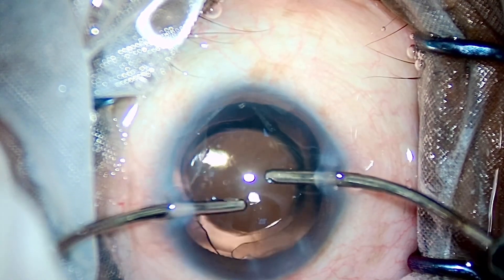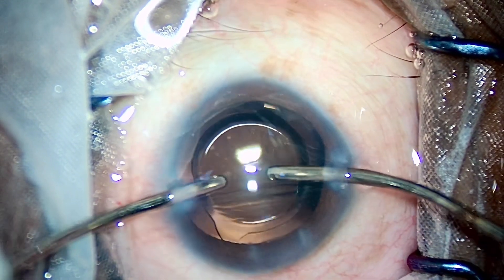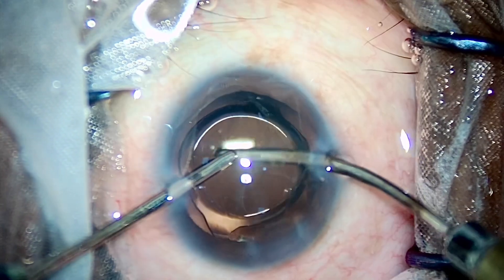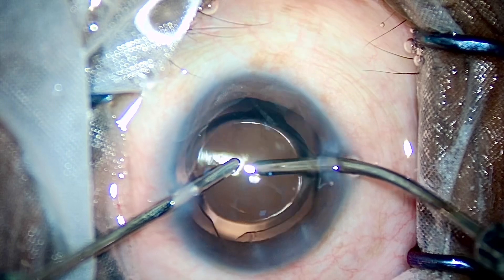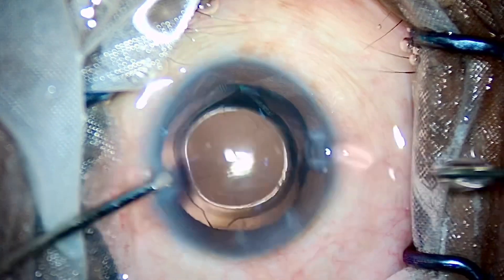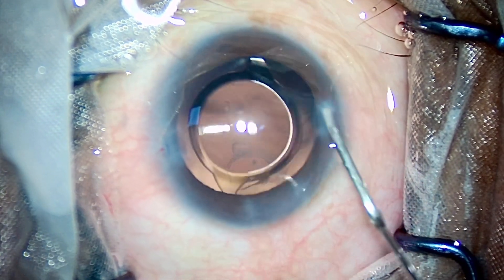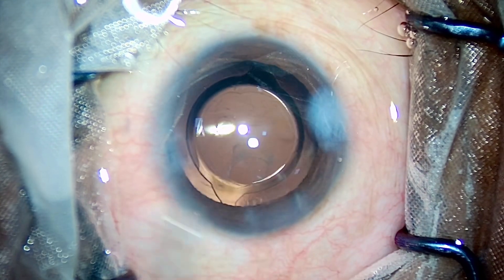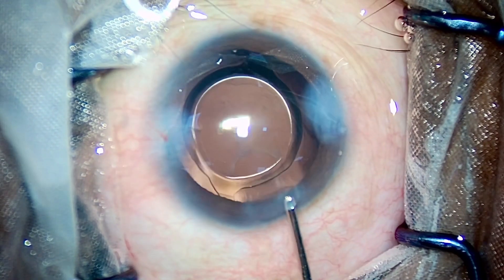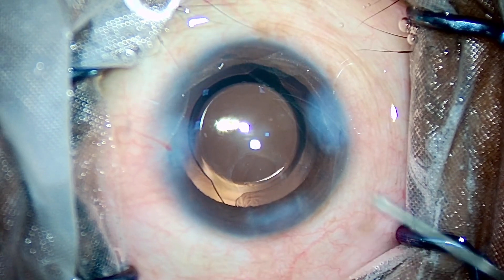I have implanted a pre-loaded Simplicity Johnson and Johnson monofocal IOL in this patient. As soon as I implanted it, the IOL had kissing haptics and I separated it right away, implanting the IOL in the bag. It was just a fun case to share with you all — I hope you liked my video. Cases like these come along and it's a joy to share these strange and peculiar cases that make you smile along the way of your residency. Hydrating the main port at the roof — that's all from my side, thank you so much.